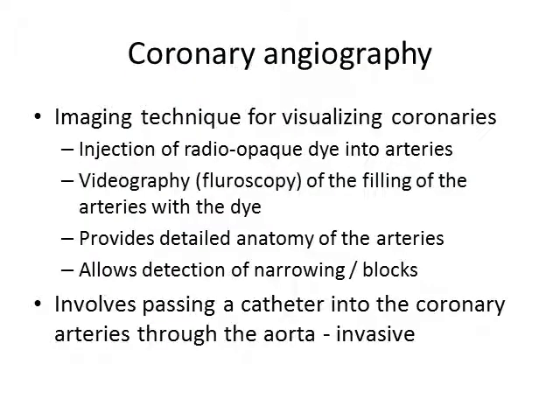In this brief video demonstration, we will look at the basics of coronary angiography. Coronary angiography is an imaging technique for visualizing the coronary arteries. It involves the injection of a radio-opaque dye into the coronary arteries and capturing a series of X-ray images.